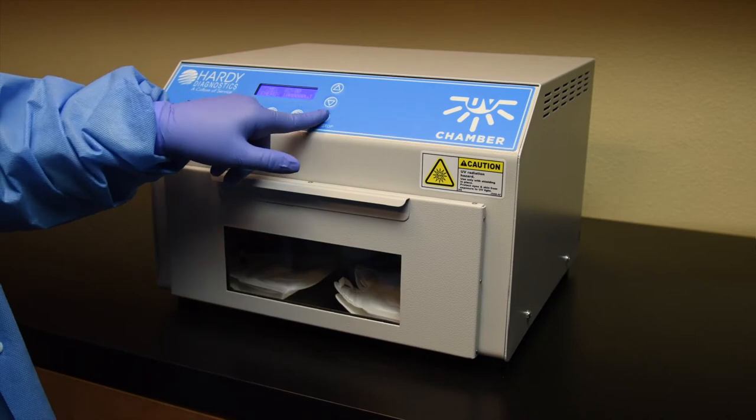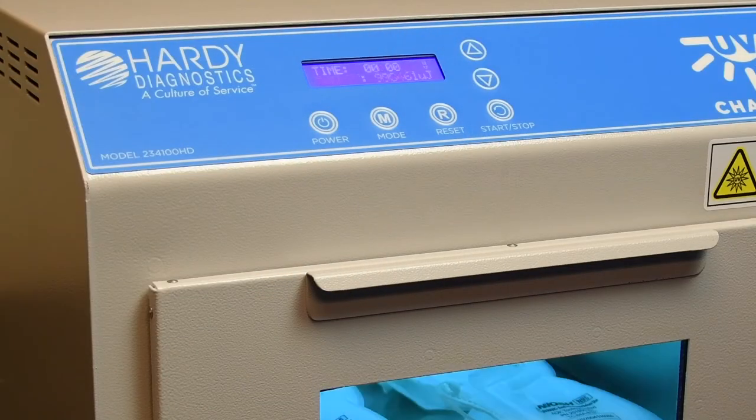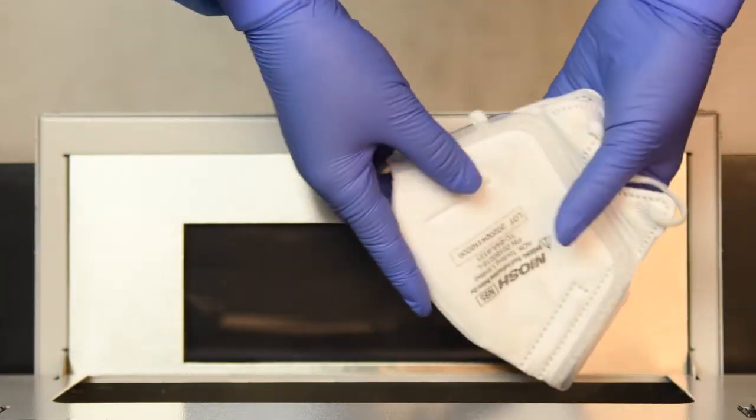Close the unit, then press Start. When the cycle is finished, open the unit and turn the N95 masks over.